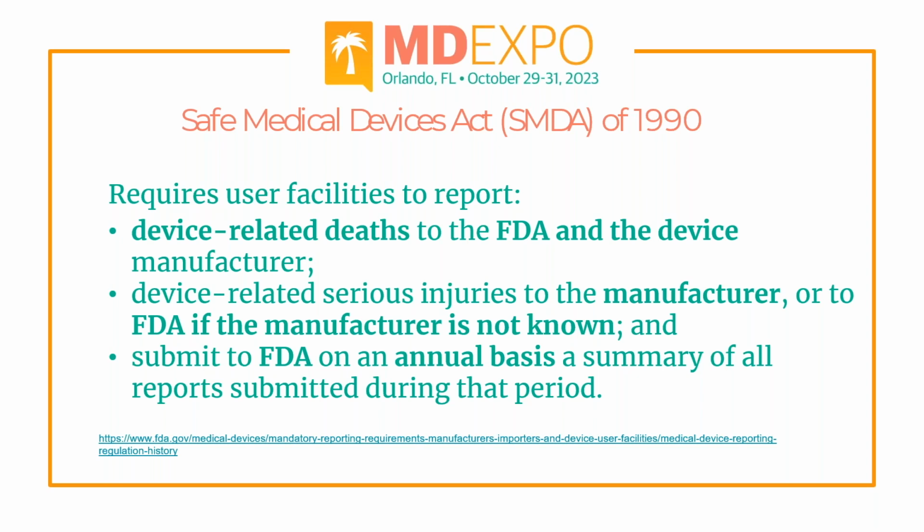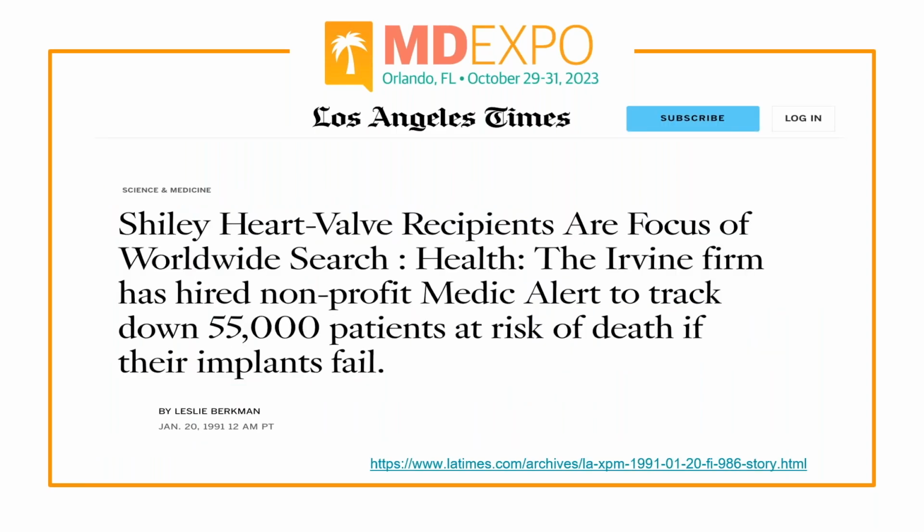If it's a serious injury, it should be reported to the manufacturer, and if you don't know the manufacturer, it has to be reported to the FDA. And every year you have to provide a summary of those incidents to the FDA. If you need more information, here is the link. So that's the user reporting requirement of the SMDA, the Safe Medical Devices Act.